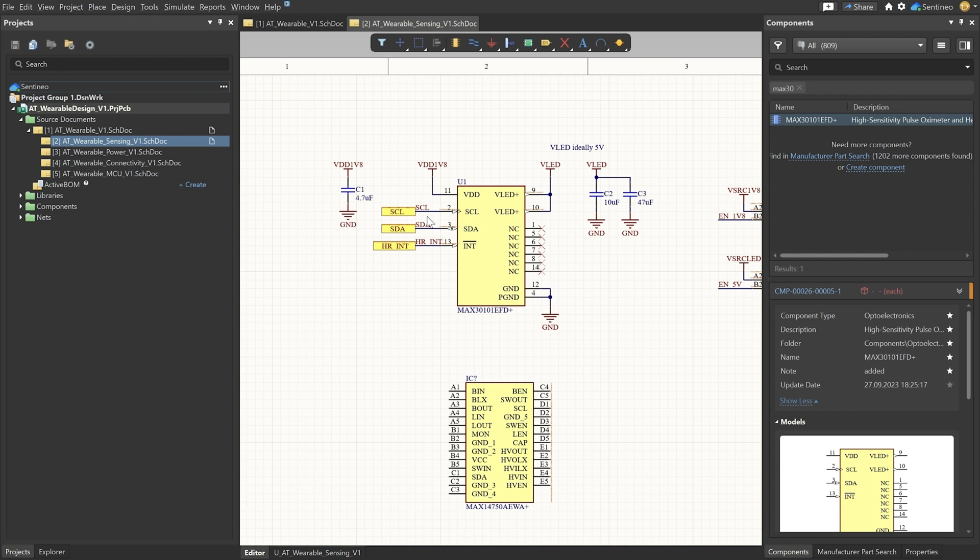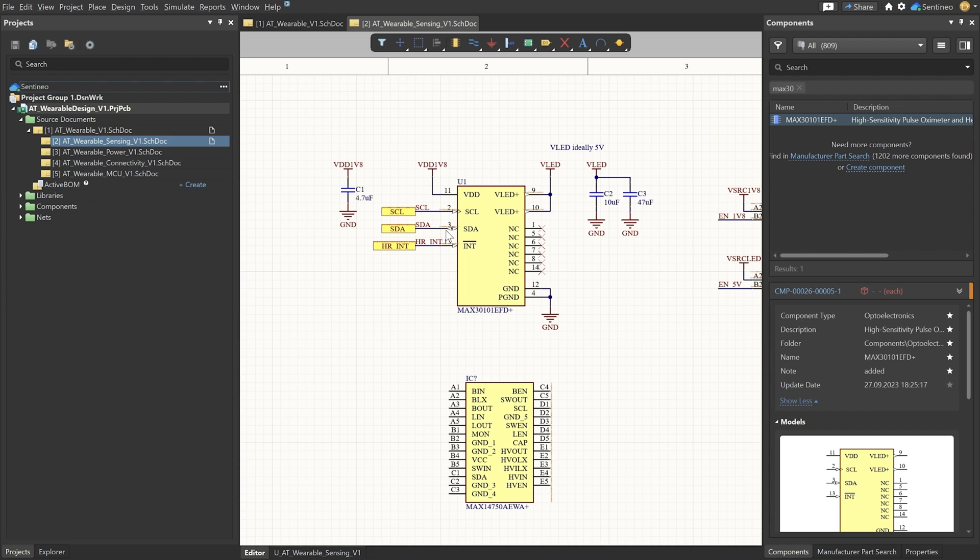There will be pull-ups needed on both the I2C lines and also on the interrupt line. But they will be tied to an external voltage, depending on the microcontroller voltage that we're going to use. We will tackle that in a later video. So for now, I have just foreseen ports. It will come externally and will handle these things externally in another schematic doc. Most important thing in the sensing schematic doc is that the sensor is in there.